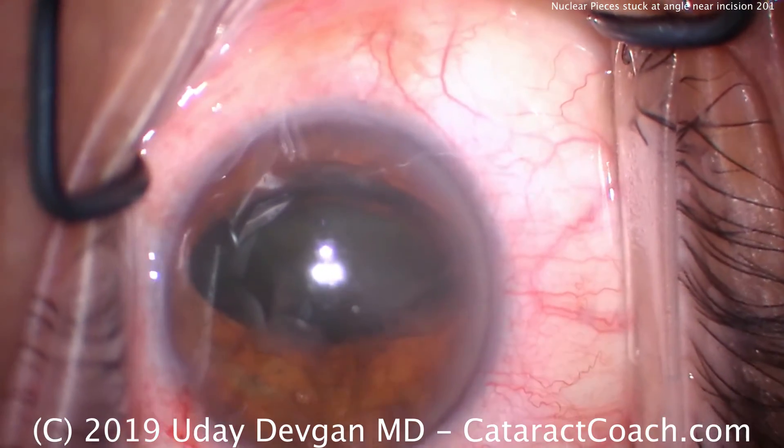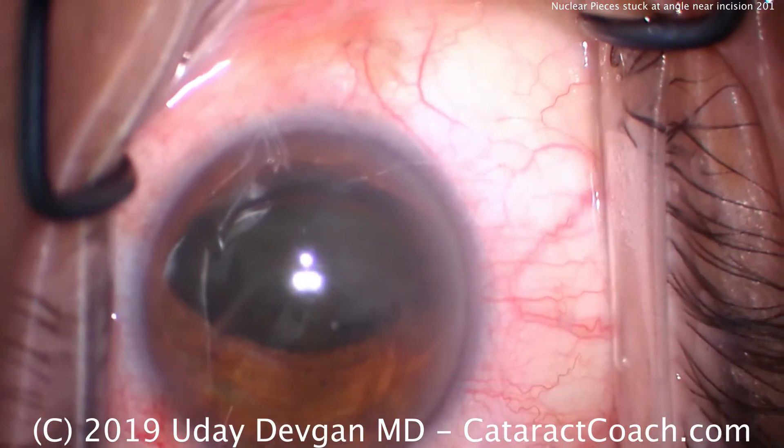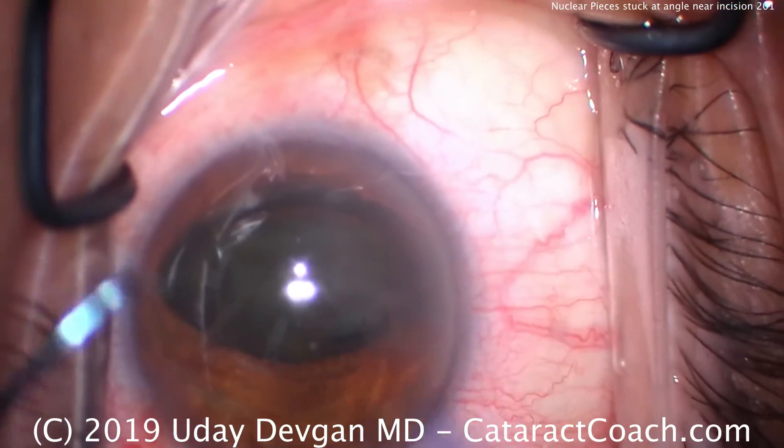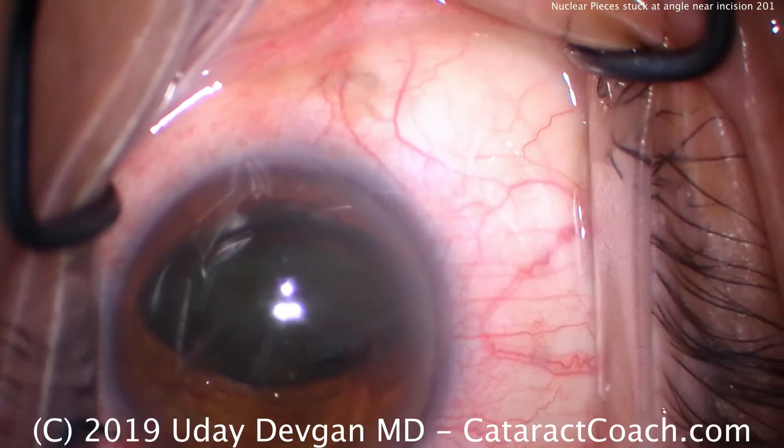Let's recoat the endothelium with a dispersive viscoelastic. That looks great. And now put the phaco probe in the eye on the high-flow, high-vacuum setting.